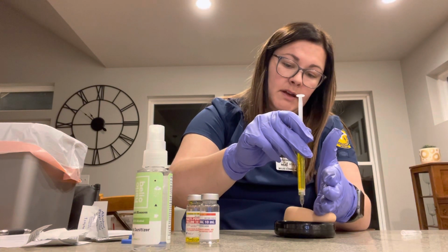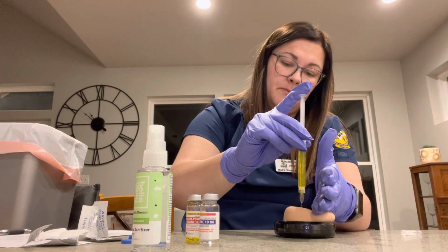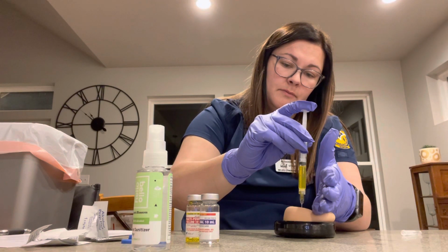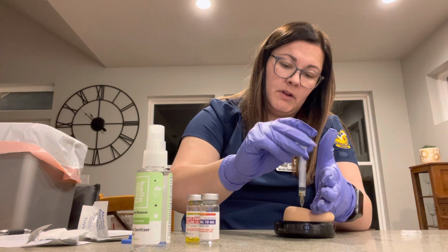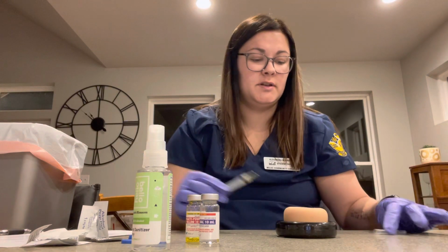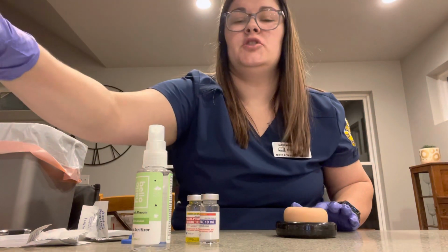aspirating for 5 seconds. If there's any blood return, I will immediately remove the needle. Because there is not, I can then start to administer. I will quickly remove the needle and let go of the skin in order to trap that medication inside. I will then recap my needle and enter this information into the MAR.